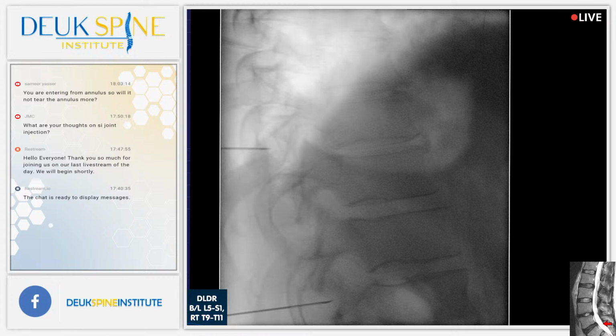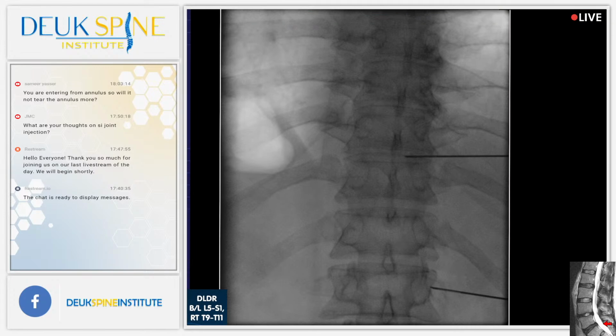1, 12, 11, 10. If I can get in, yeah, I'm too medial. And there's 12, so I'm at 1, right? Yes. You agree I'm at 1, you can see it there. That's 12, 11, 10, 9. So basically, 1 is reliably without a rib. Everyone agrees? Yes, sir.